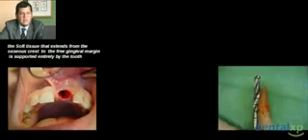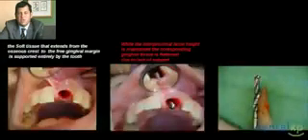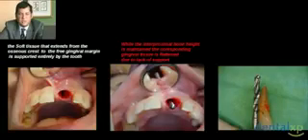The proximal height of bone is a major issue in late loading. In immediate implant placement and immediate restoration, maybe it's less important. The 3D positioning of an implant has a key impact on the aesthetic outcome.